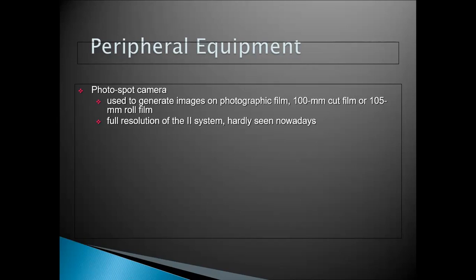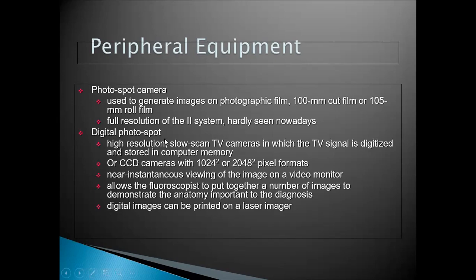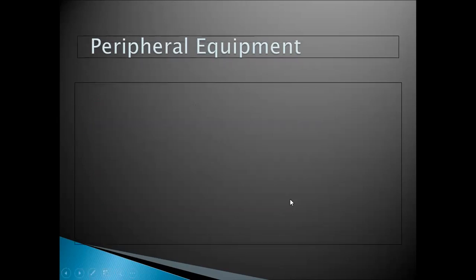Of course, this is an old system. In today's modern systems, it is a digital photospot camera that is used. So it has a high resolution. Of course, the signal is digitized and stored, and can be printed on the laser printer if required.